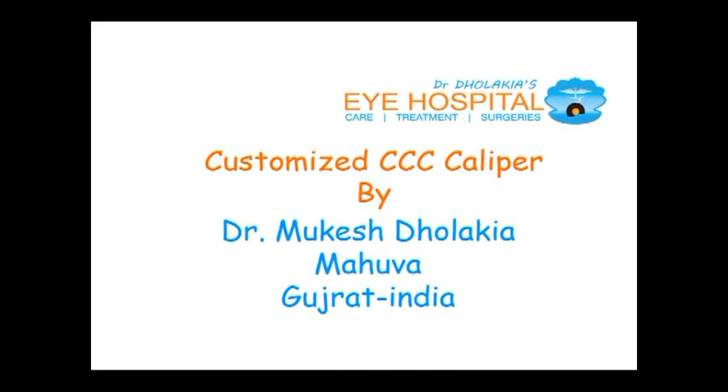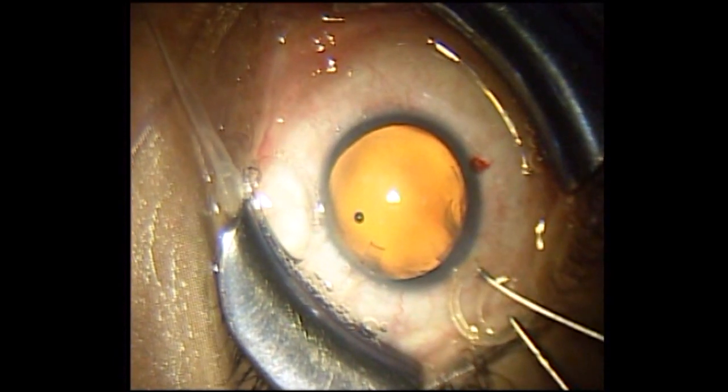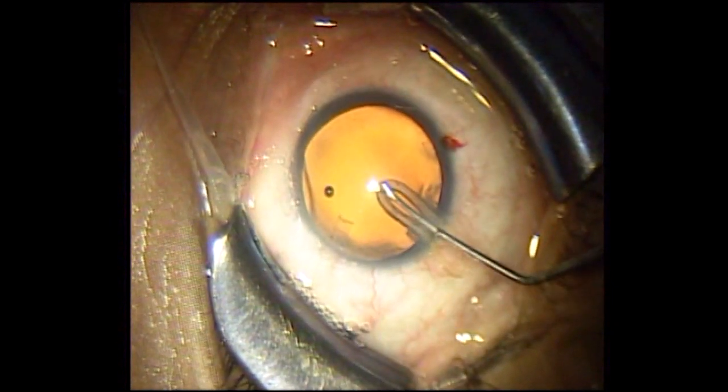I would like to show my customized CCC caliper. Let us see how it works. You need to introduce the CCC caliper — it is a silicon ring — with the help of a Y-fork, inside the anterior chamber of the eye.